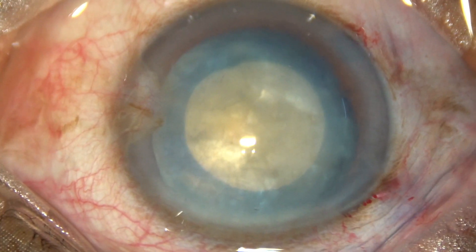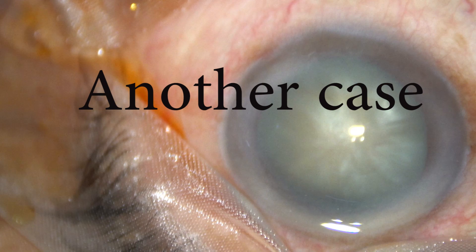And now it looks like this. Now let us see another case.